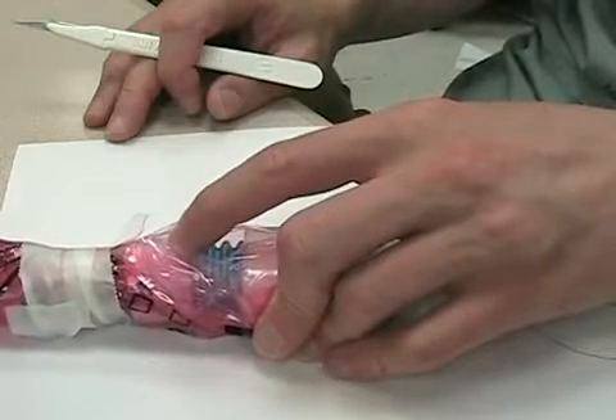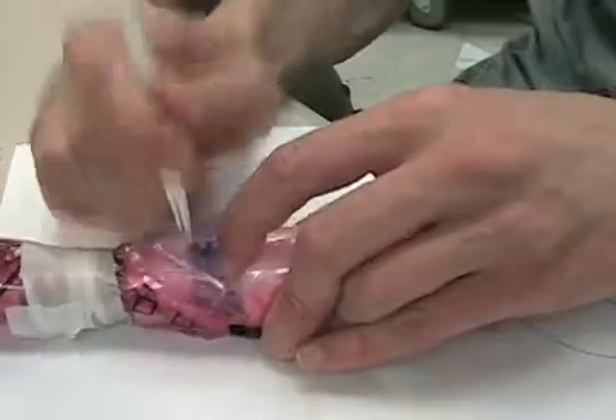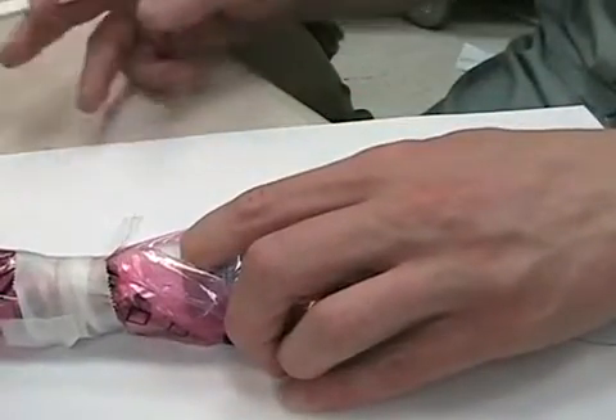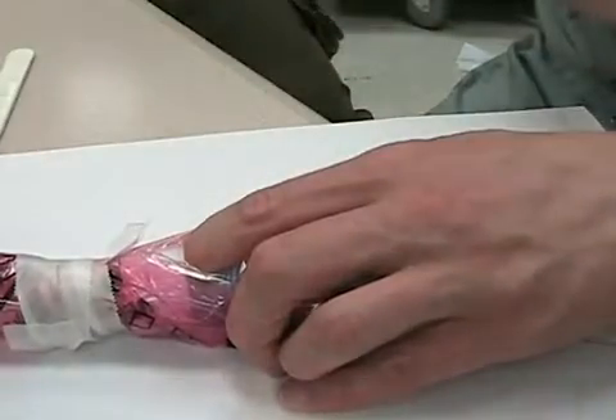Once you find the membrane, right above where the cricoid cartilage is, you're going to make a horizontal incision through the full length of the membrane. Now get your finger inside the trachea. I have my finger just above the cricoid cartilage, inside the trachea, and my finger is not going to leave there until I get something else in.